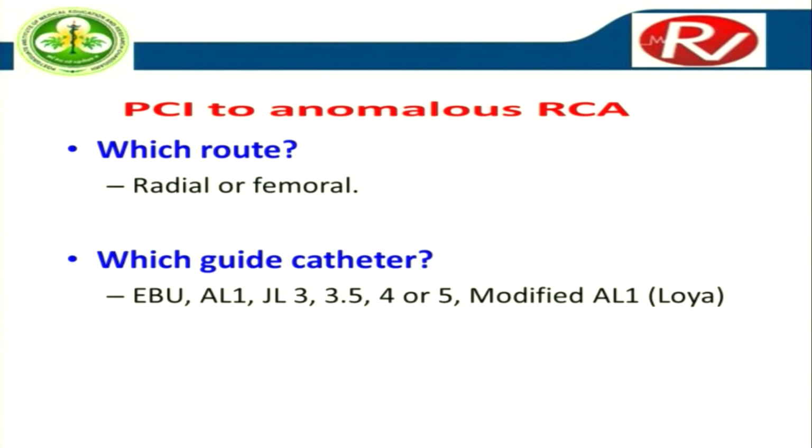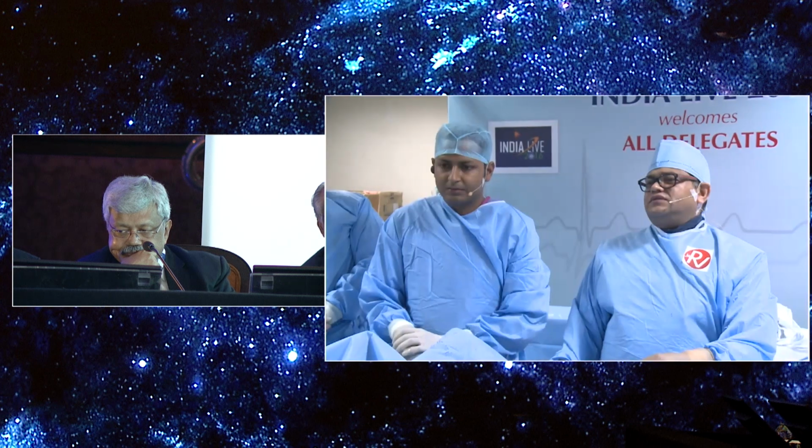My question to the chairperson and moderator: which route should I take, radial or femoral? And which guide catheter should be taken for this particular case? Any comment?